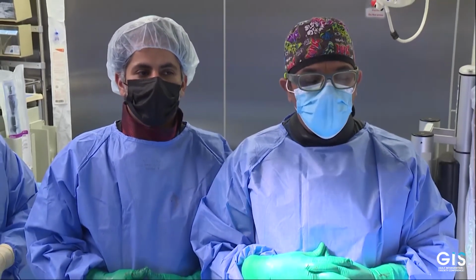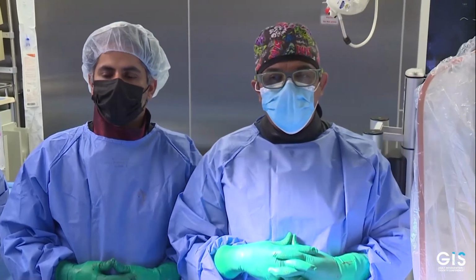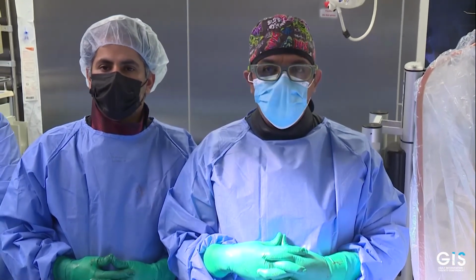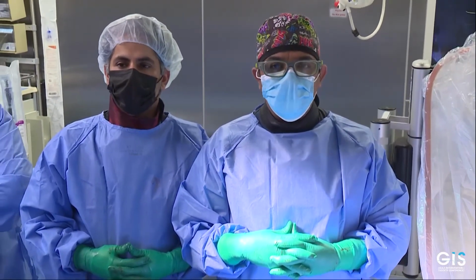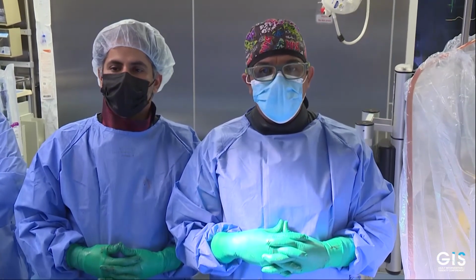Also, we attempted to prevent any risk of a stroke in this patient by using the cerebral protection device Sentinel in this situation. We also showed you a different alternative approach that is minimally invasive for the pacemaker placement through an antecubital vein.